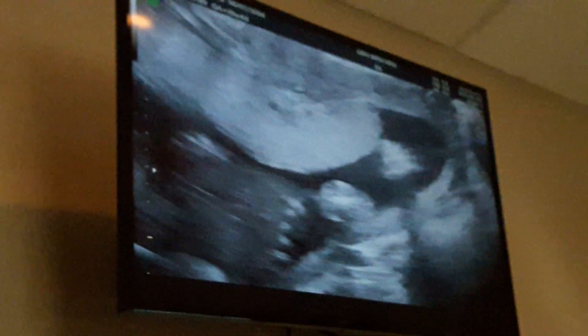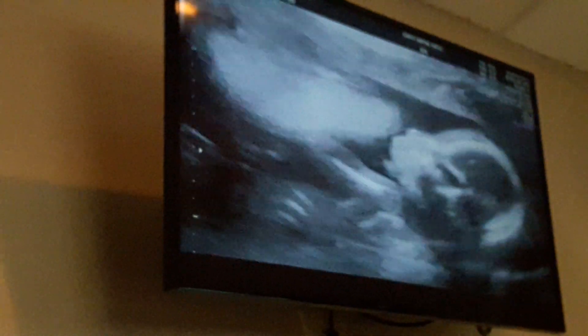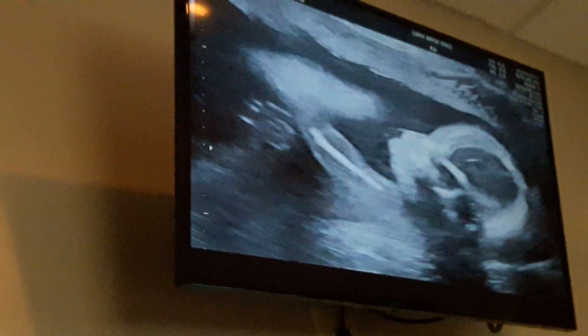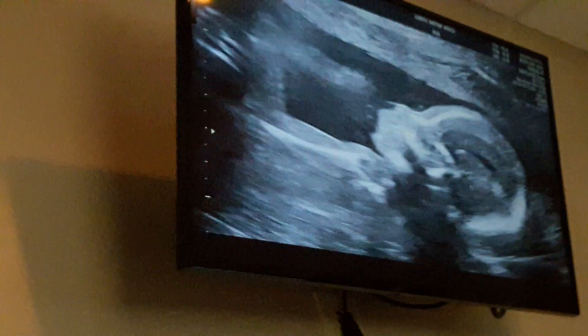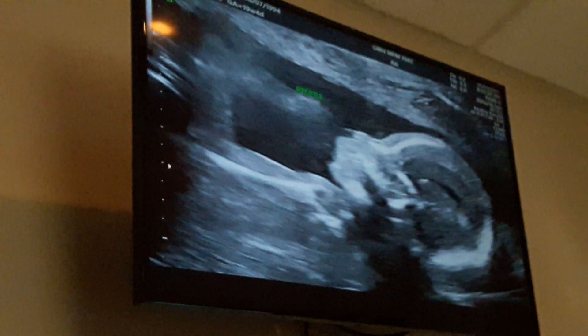You see the mouth is open, huh? We're getting the hand just in front of the face. You see, no more pictures. And the mouth is open. There's a foot. We're fine.